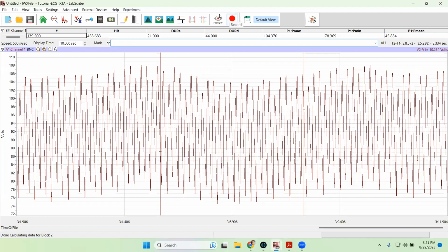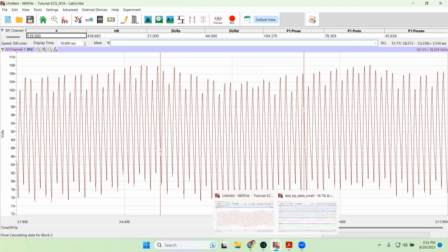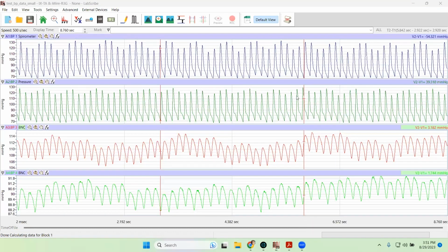The other type of calculation is offline calculation, which means the calculations are being done after the fact. So you've already had the animal on the operating table. You've done the procedure that you wanted to do, or maybe a researcher's looking for a knockout to see if a knockout variant has worked, or pressure volume loops, or whatever the researcher's looking to do with that. This will give you a data set.